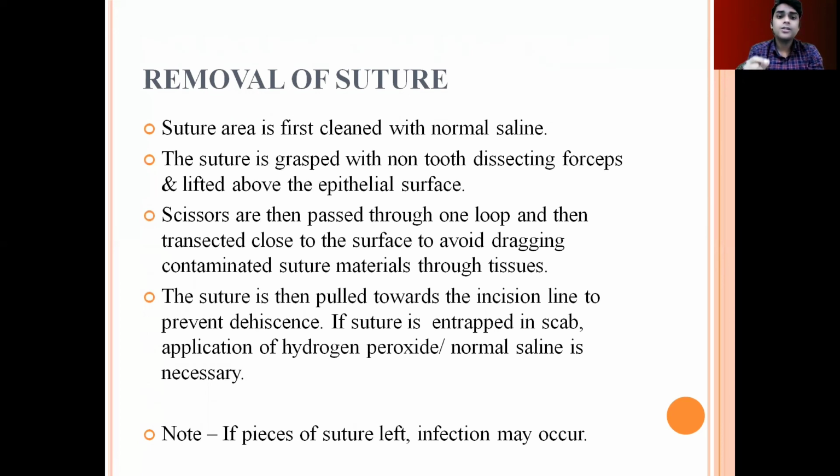The suture is then pulled towards the incision line to prevent dehiscence. If suture is entrapped in scab, the application of peroxide is important to dissolve this part. Now, something important to note here is that if pieces of suture are left, infection may occur.